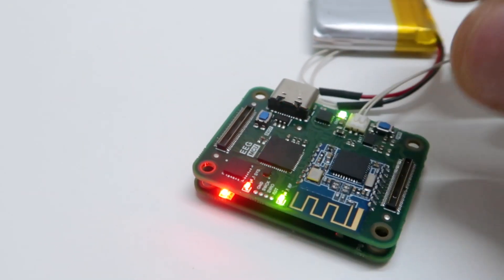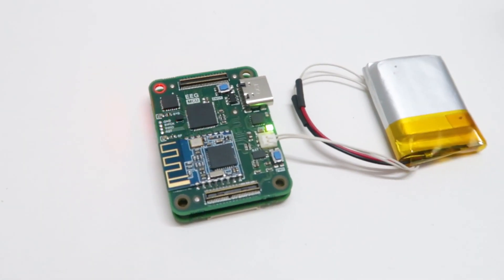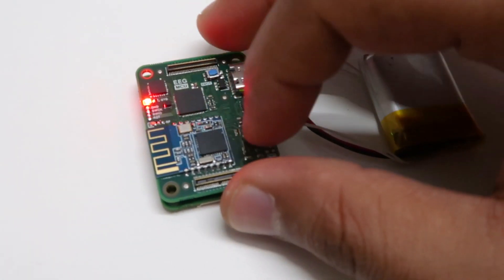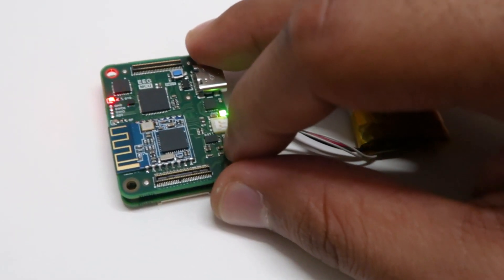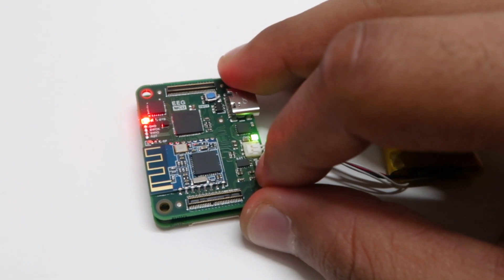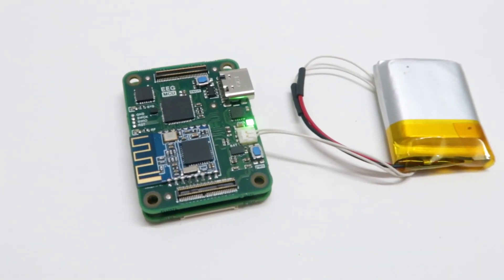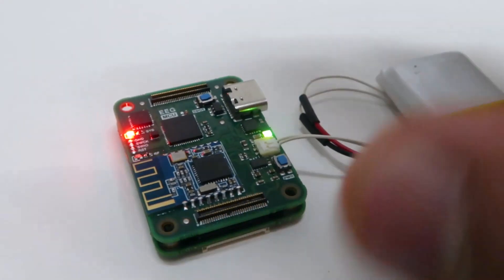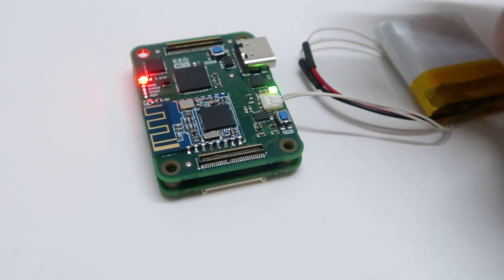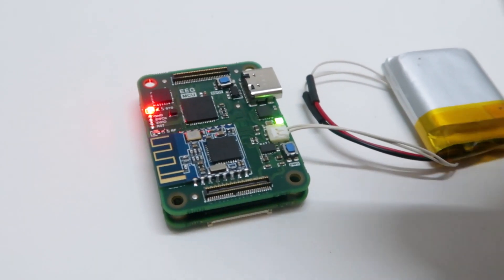Similarly, to switch the entire board off, I'm going to press and hold this button for another three seconds — and now the board is switched off. That's a brief introduction and a validation of the hardware for revision one of the wearable EEG project.